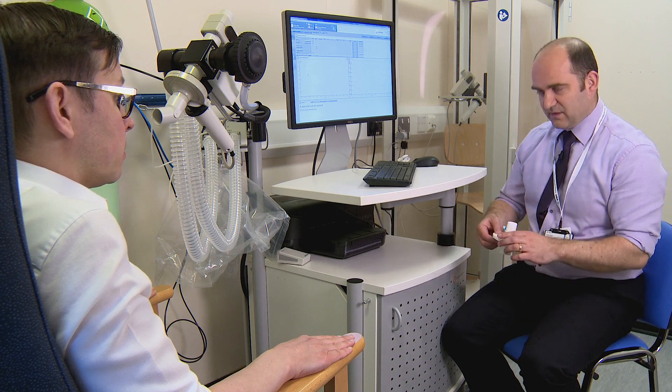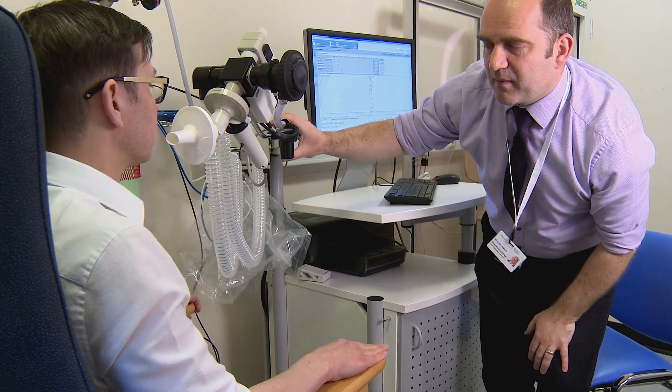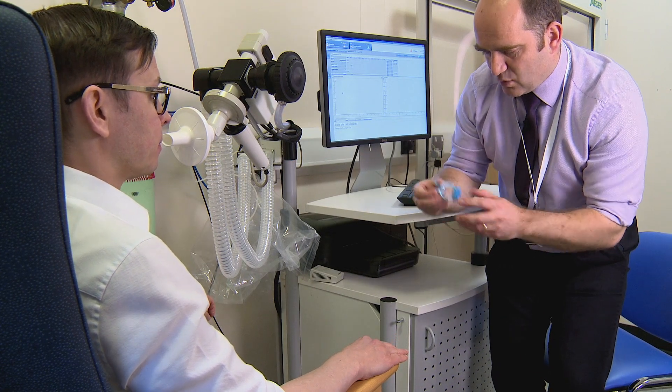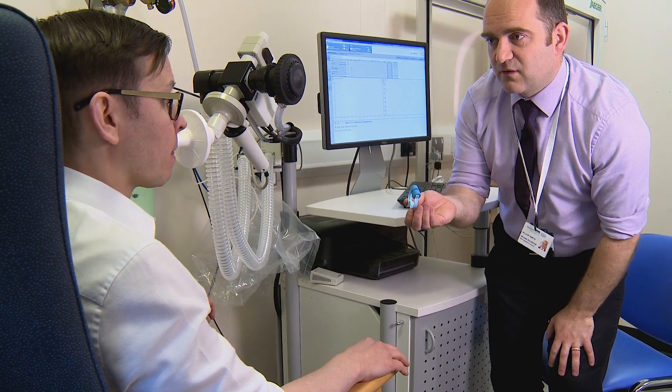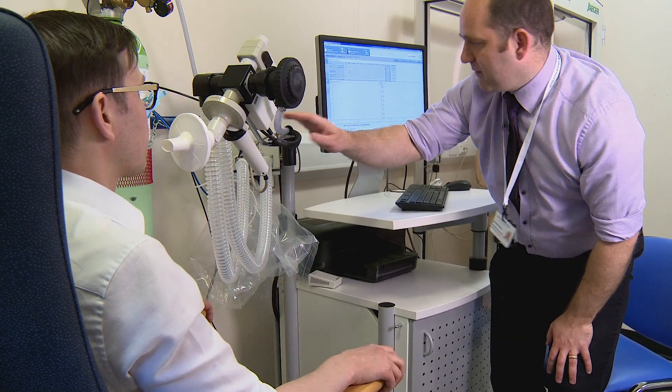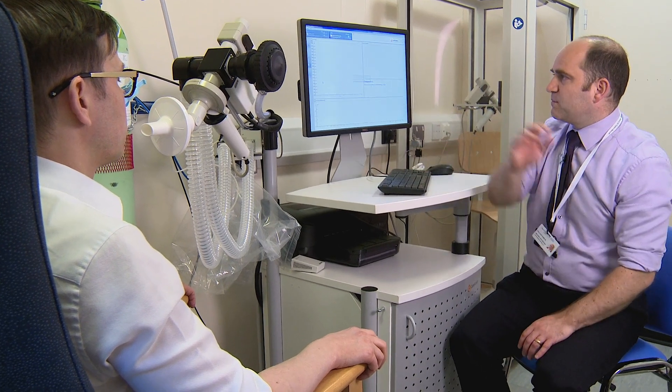First thing I'm going to do is pop the mouthpiece onto the device. So if you could pop your mouth onto the tube for me. I'm also going to ask you to wear some nose pegs on your nose as well, so if you wouldn't mind popping those on for me. I'm just going to set this machine going.